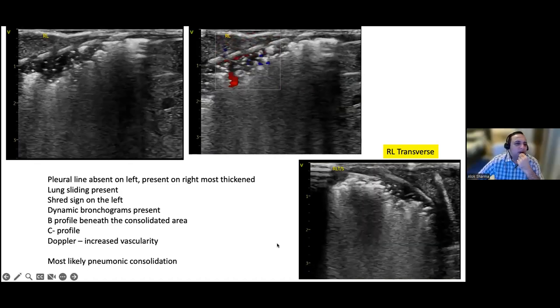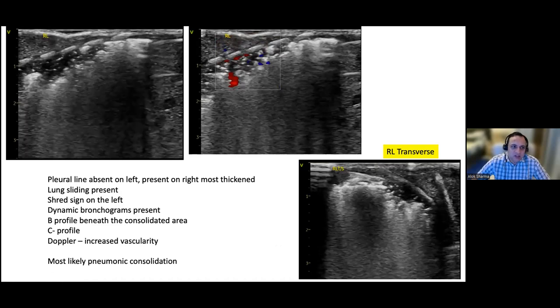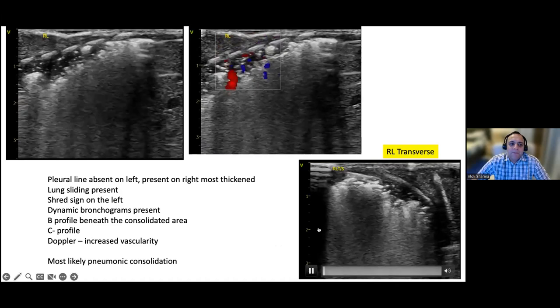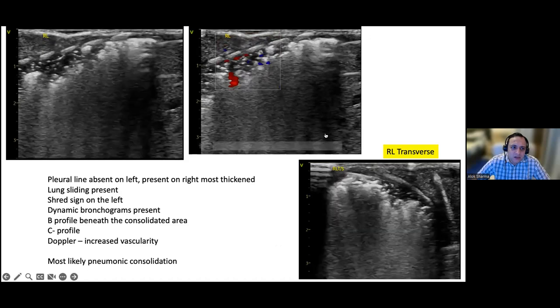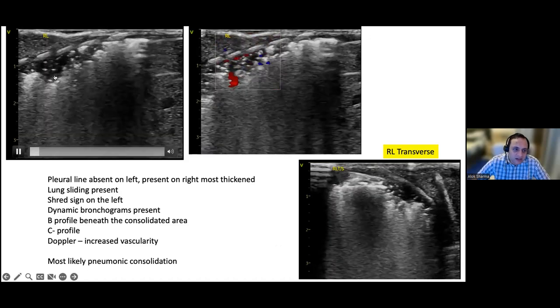Yeah, I would agree. So just for everybody, if you remember, Dr. Hassoun, can you see how irregular the margins look for that? Very irregular. There is an element here where I cannot see the irregular margins just coming to the bottom. So if you just want to go to that slide. So the irregularity is right in the center.